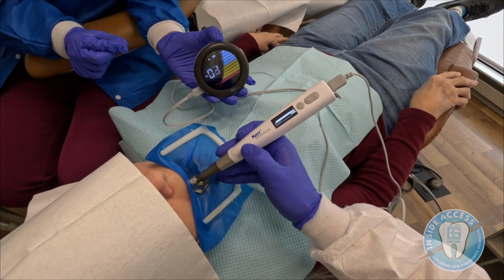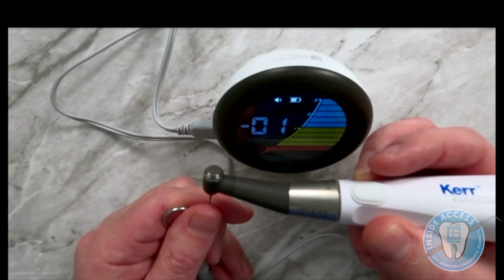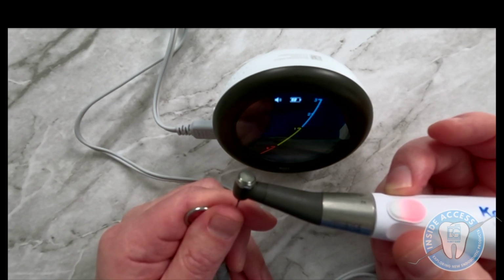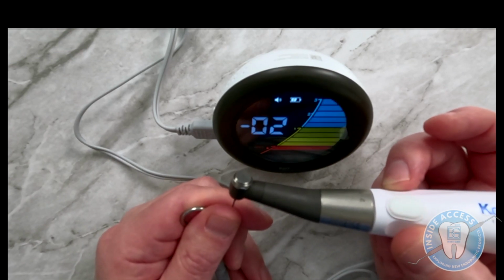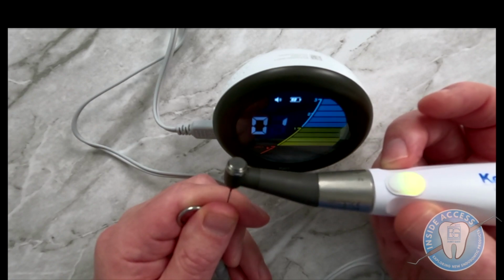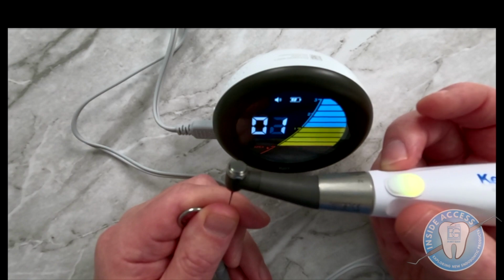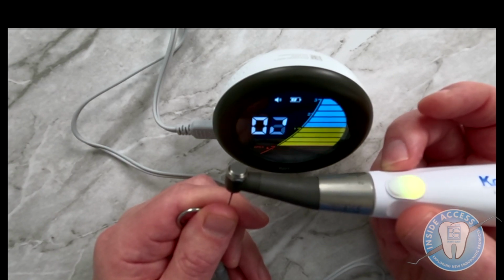Now what's important to notice is that once it hits apex, it actually has a back-off setting. So what you can do when you reach apex is it will either reverse in 3 rotations to loosen it so that you don't over-instrument, or straight reverse. So this is a setting that you can set. But you can see just how nice it is to be able to, in real time, do your apex location and know that once you've reached the apex, it's not going to continue to cut and open up the apical foramen.